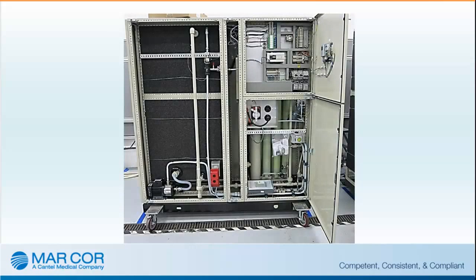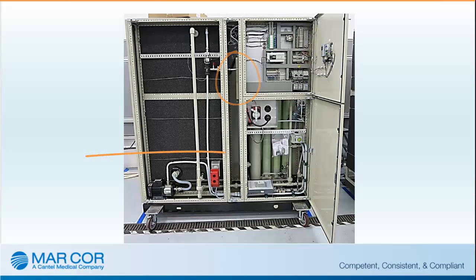An interior view of the CWP displays the hot water tank and heat disinfection components to the left. The centrally located inlet water tank, a view of the RO pump, and RO membranes can be seen on the lower right of the CWP. The chemical disinfection pump is located on the right side of the CWP below the electrical components.